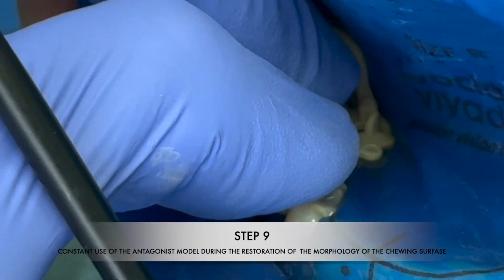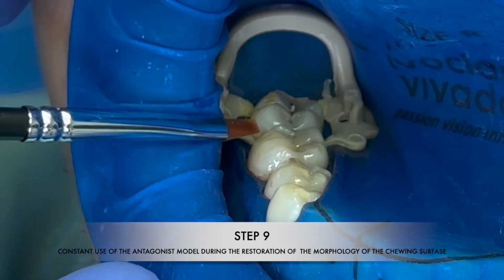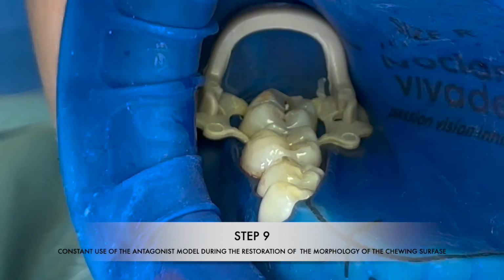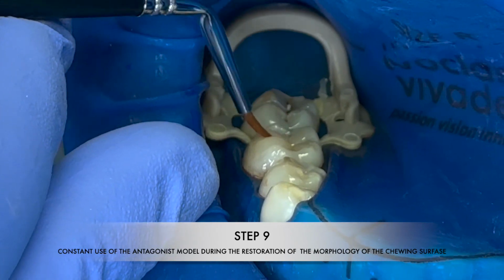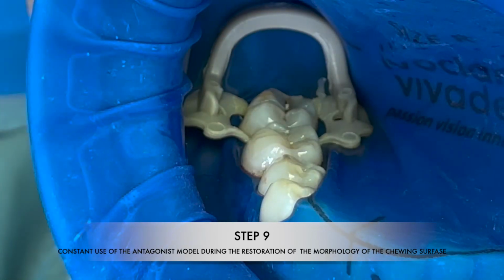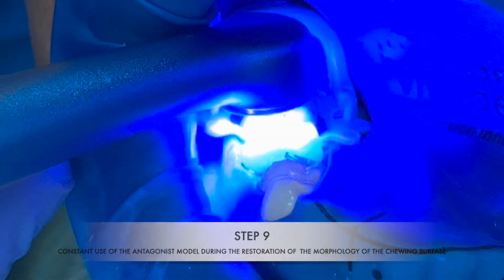Further, in the process of modeling each morphology detail before its polymerization, we put the model on top, press it, and bring this morphology detail to contact with our model. After that, we remove the model and polymerize the finished restoration detail. And so, step by step, detail by detail, we create an exact morphology immediately in occlusion.